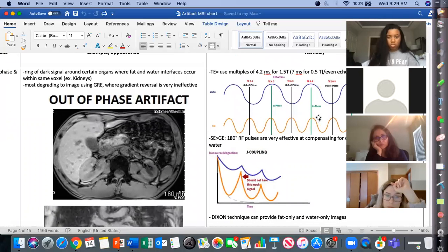All right, so we use this to detect certain pathologies, and that can be with this Dixon technique. So sometimes we want to have out of phase and in phase imaging. What we do to get that particular type of imaging, Dixon imaging, is set multiple TEs. So we have, you know, a fast spin echo where we sample multiple echoes per TR. So we select multiple TEs.